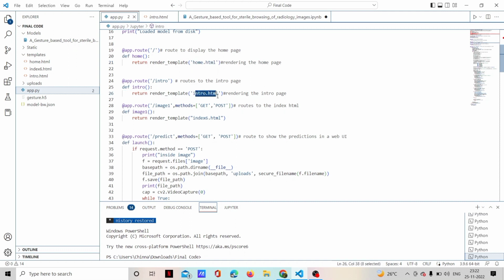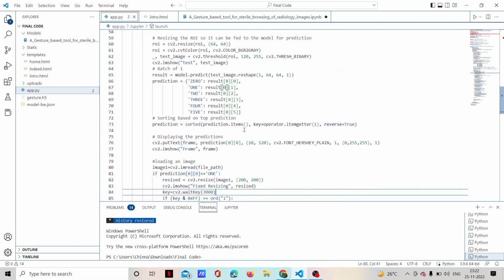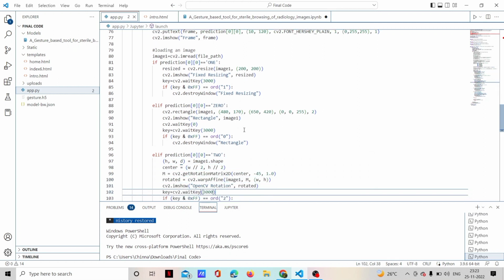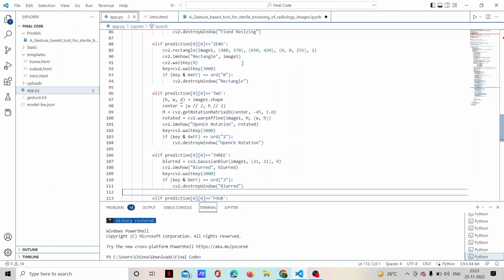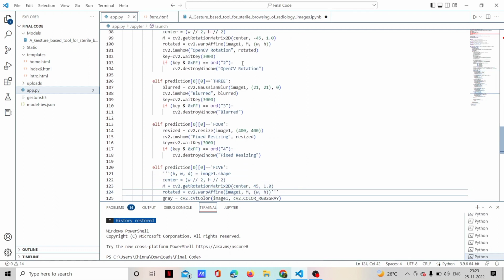The predictions for hand gestures: 0 is for displaying the radiology image in a rectangle. 1 is for resizing the image to 200 dimensions. 2 is for rotating the image. 3 is for viewing blurred images. 4 is for resizing the images to 400 dimensions. And 5 is for viewing the image in grayscale.